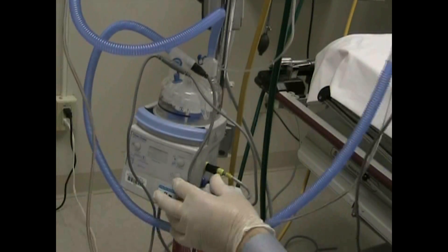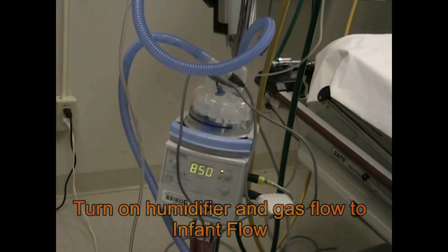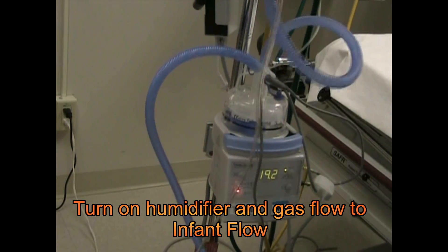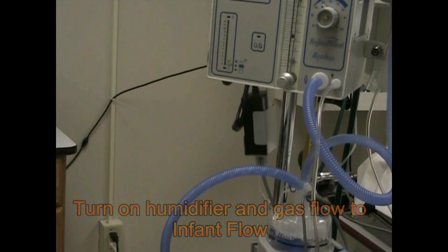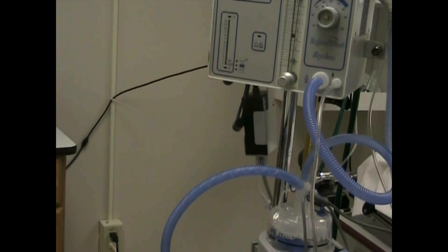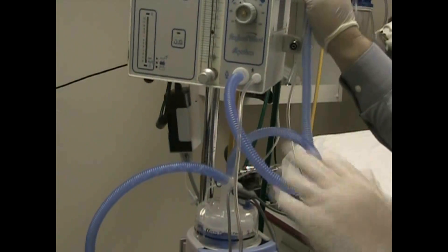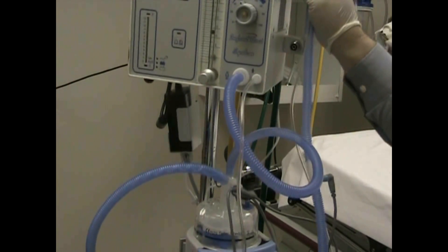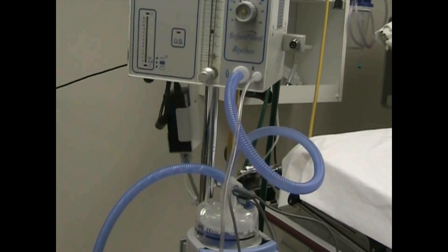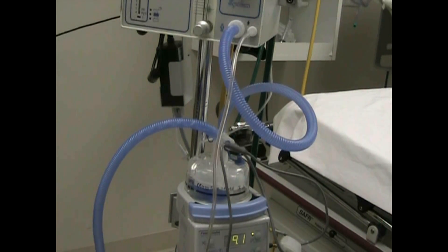Now we're set. We can go back down here, turn it on, and we want to turn on the flow at the same time. We're going to be getting alarms until the system warms up, but this will allow us to have airflow going through, allowing the heated humidifier to heat up and get prepared for the baby while we put the bonnet on and size the cannula.